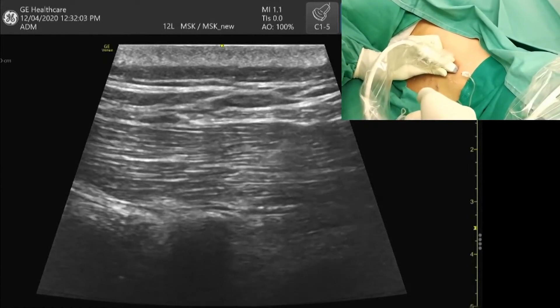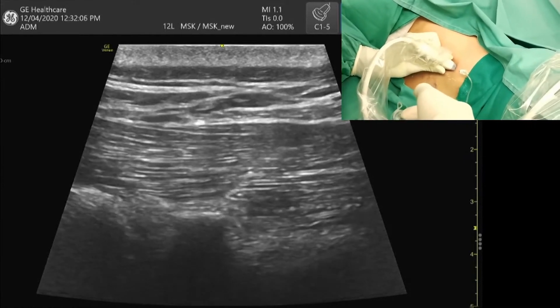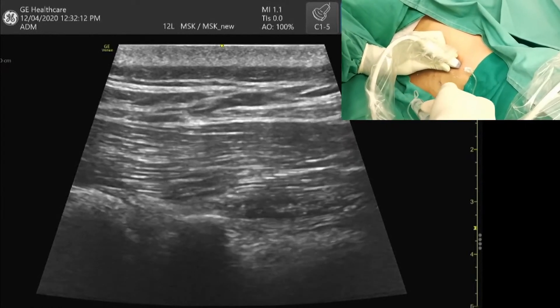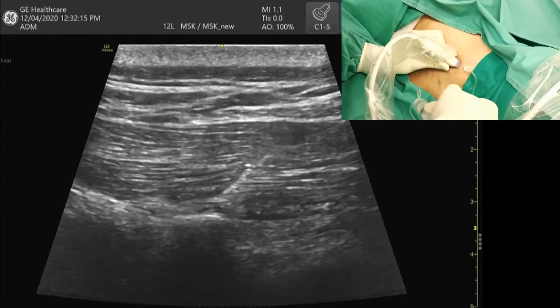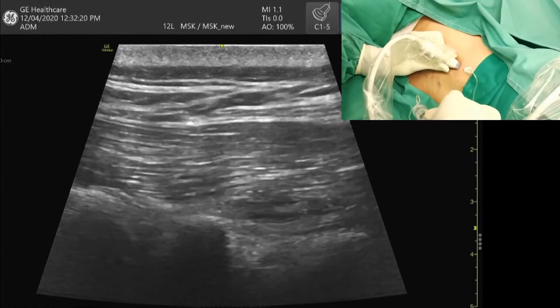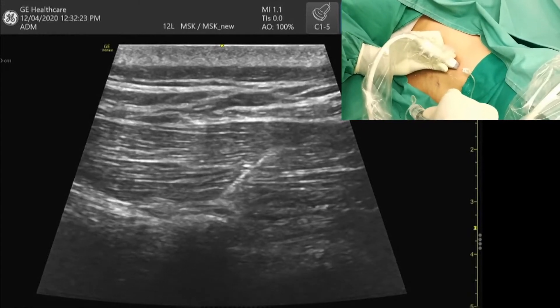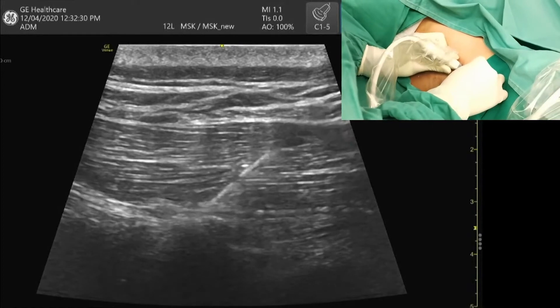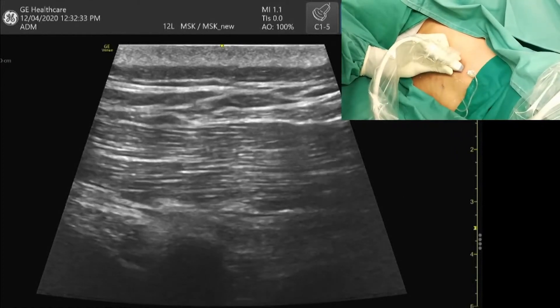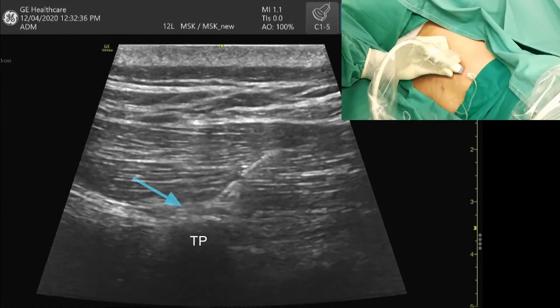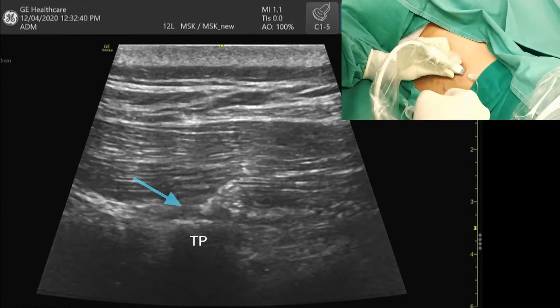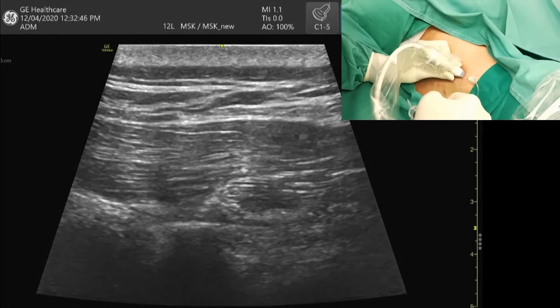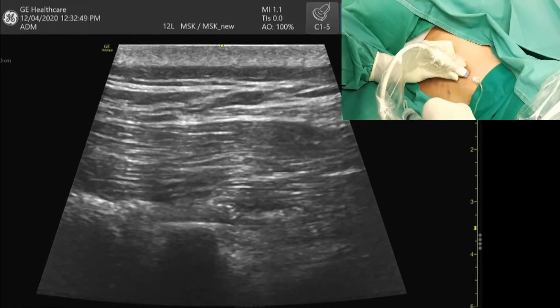If I stop injecting, you can see the column of local anesthetic will start to drop — this is called the pumping effect. I'm using 0.375% ropivacaine. This is a volume-based block, so you have to use a higher volume and a lower concentration. The minimum volume suggested is 20 to 30 mils, because you want that spread of the local anesthetic. You can see the LA is spreading at the plane between the transverse process and the erector spinae muscle, and when I stop injecting it will collapse — that is the pumping effect.